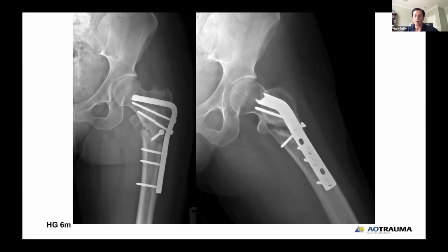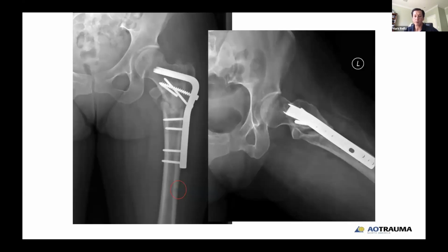So, an unusual problem, not something easy to read about. I reach out to my colleagues and my friends, and I think it was Keith Mayo who told me that sometimes the second time around on an osteotomy, you now don't have clean surfaces, you'll have irregular surfaces because of the non-union, and now it will achieve compression. And so I went back, removed the blade, inserted a new, actually the same blade, but same dimensions, but in the same path. And all I did was use the articulated tensioning device and provide axial compression of this.